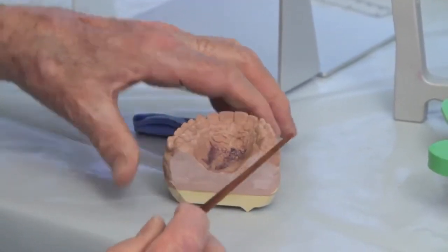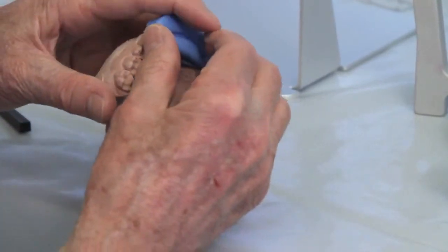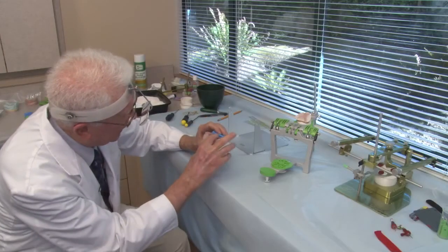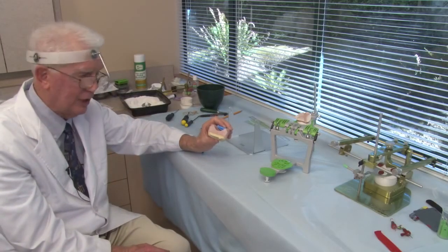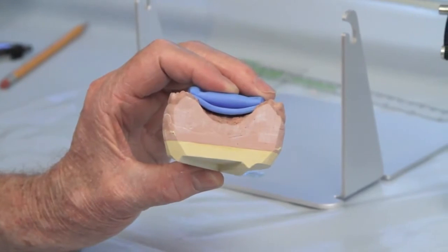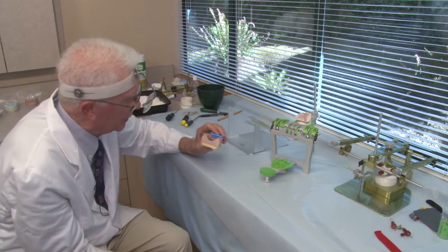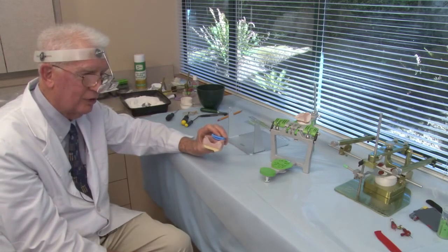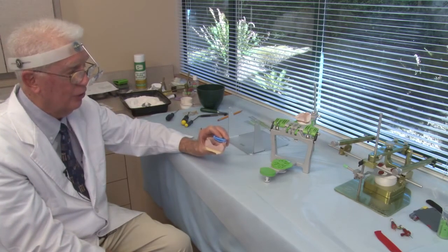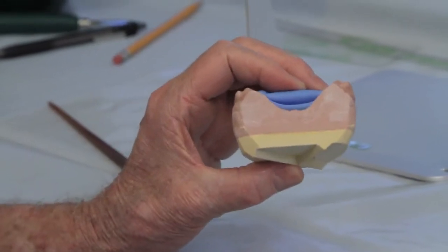It will not depress. So that if you try to put your wax bite on the model, it doesn't fit solidly. There's a little movement, because the wax is touching the hard cast on the lingual surface. So I've got to cut away the wax to make sure that it clears all the hard tissue on the lingual. You only want cusp tip indexing, so I have to cut away down to almost the incisal edges. And so I have quite a bit of trimming I have to do on this wax bite before we can use it. But always check, like I'm doing now, looking from the lingual, and it's very difficult to see.